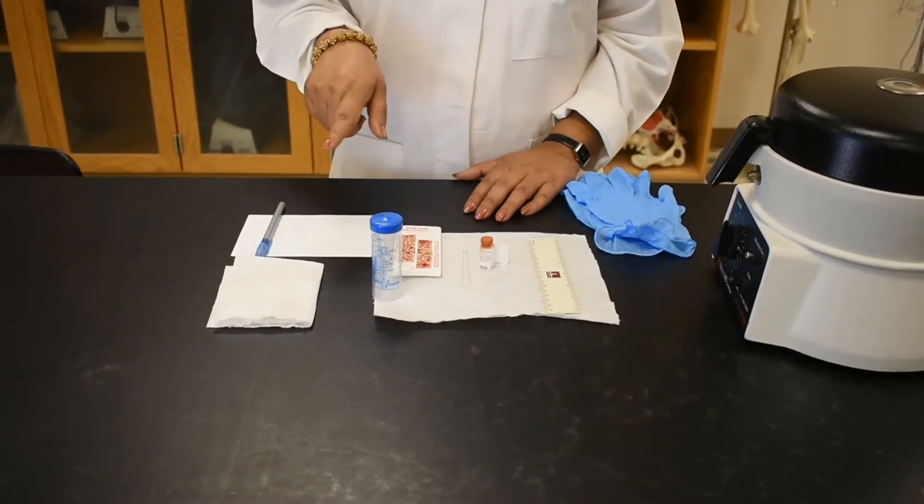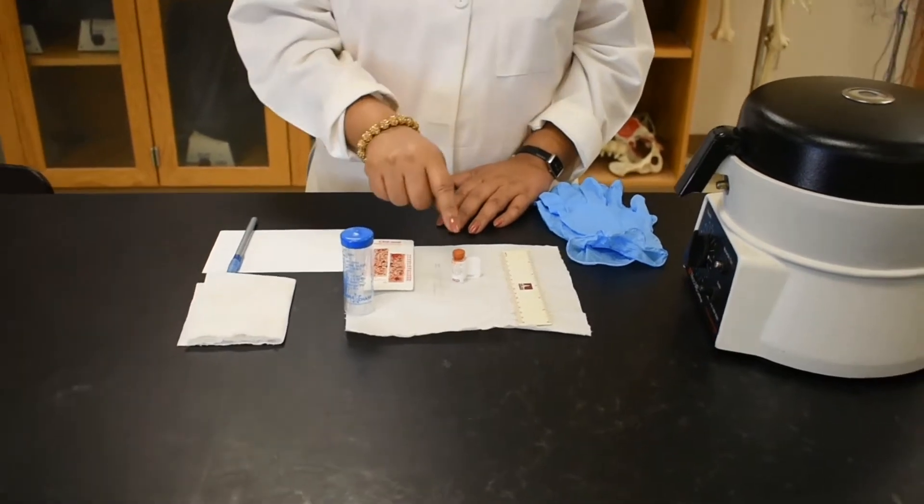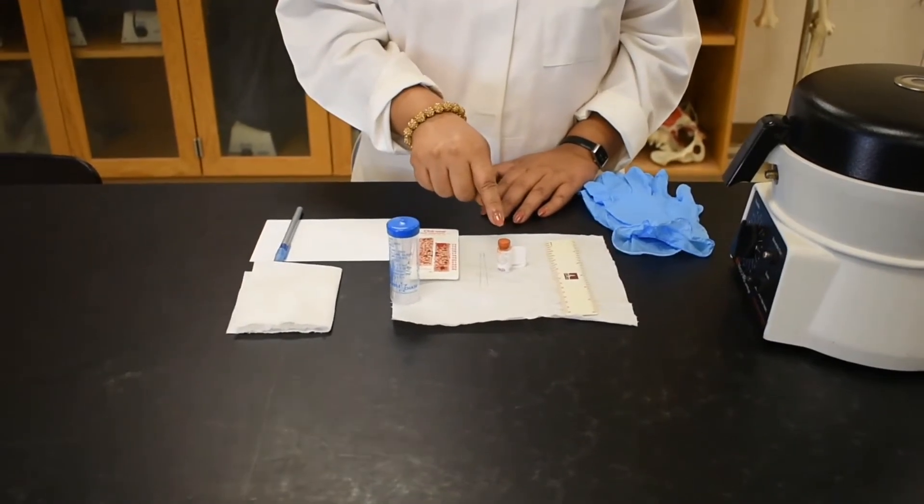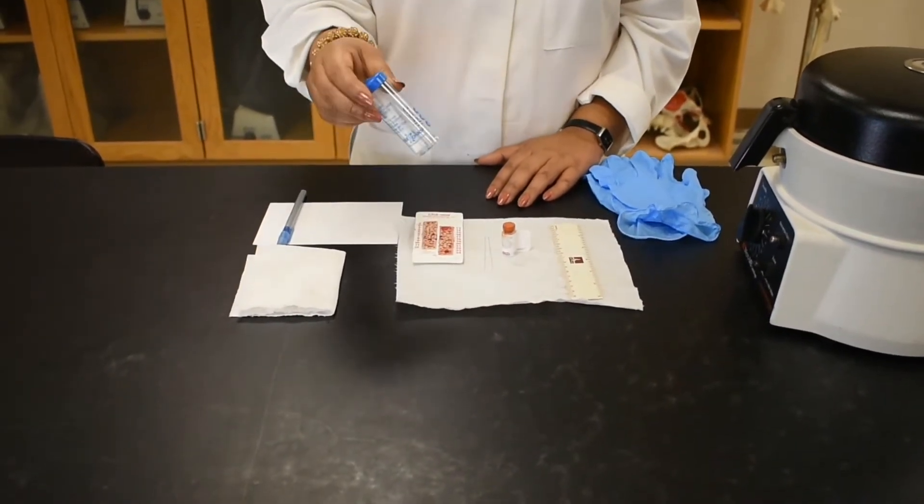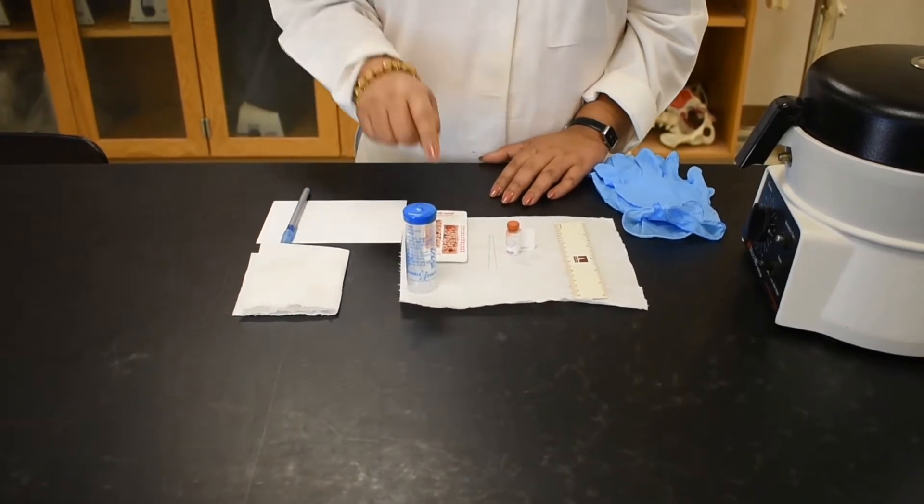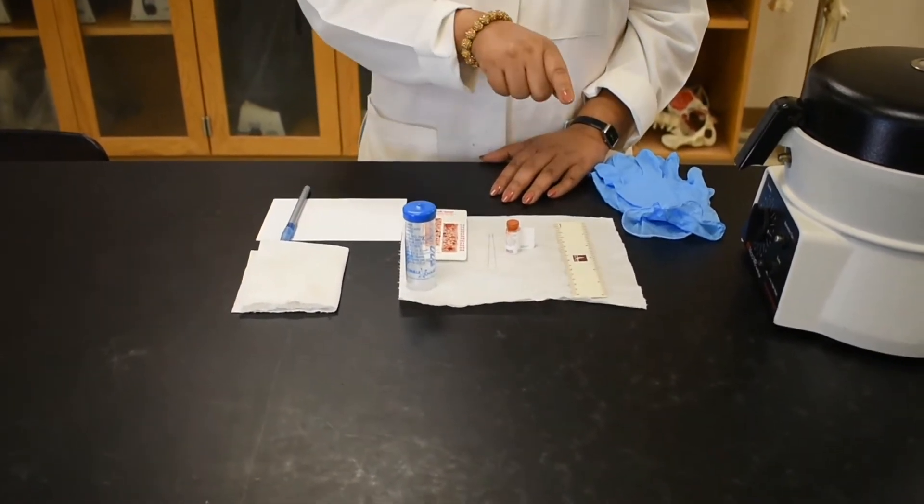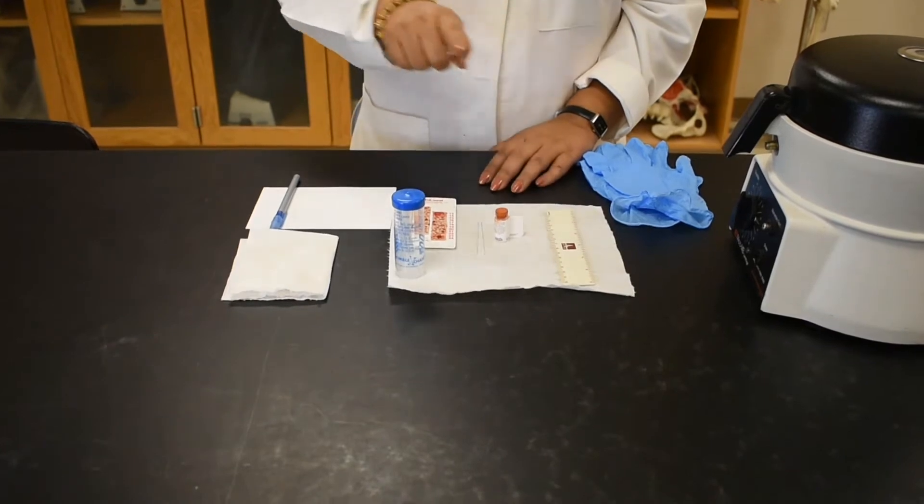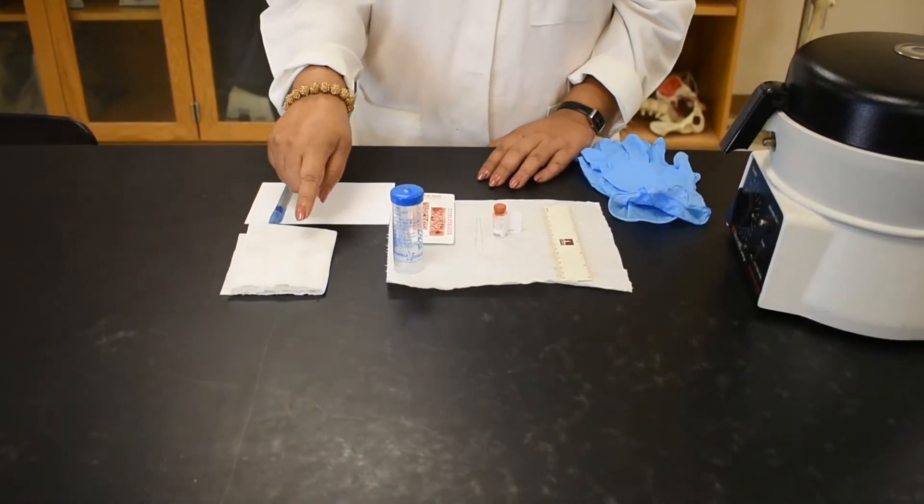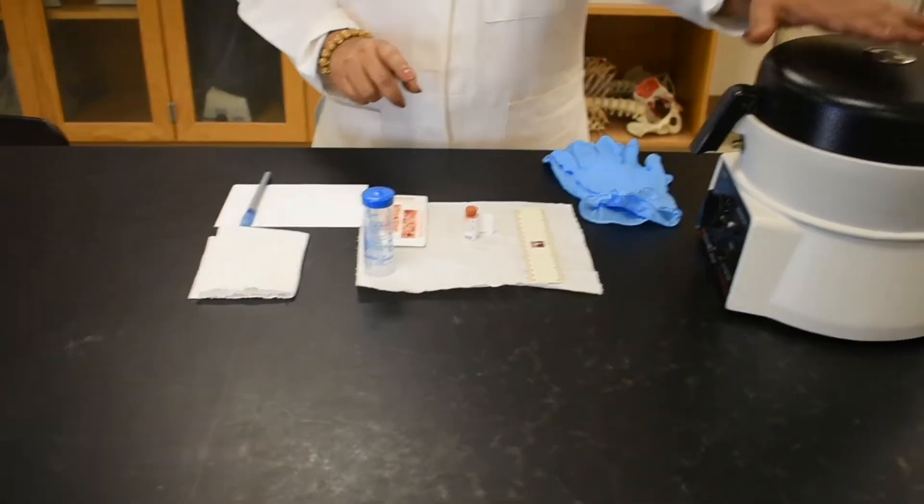These are all the materials we will need for the experiment. We need blood sample, capillary tube, a sealant, a ruler, an extra paper towel, and a micro centrifuge.